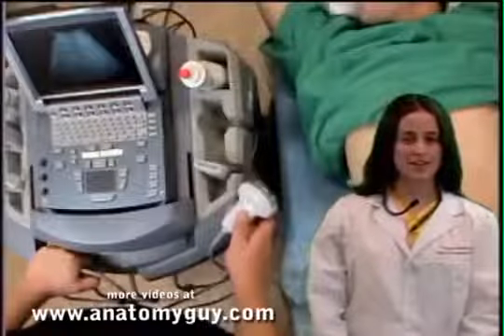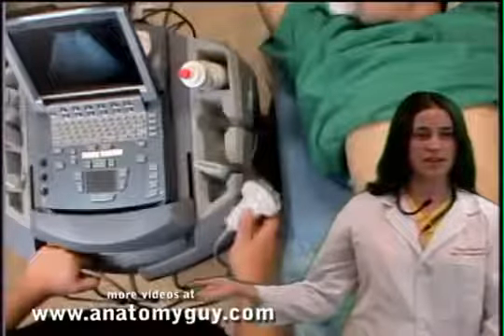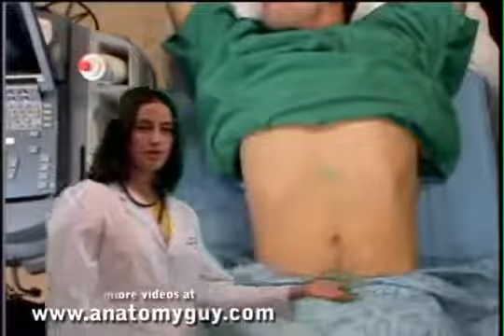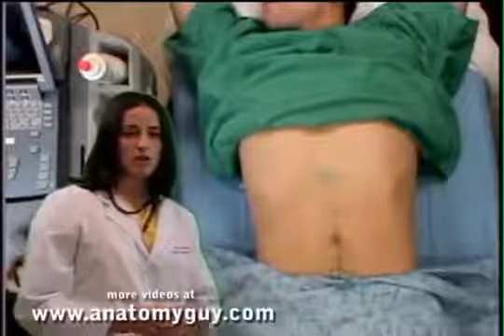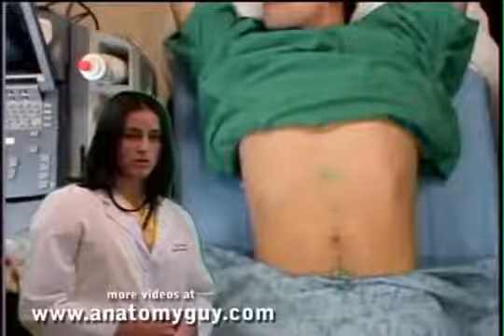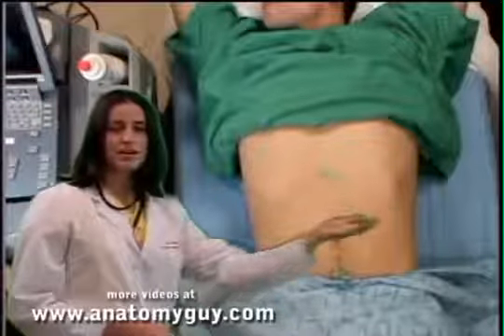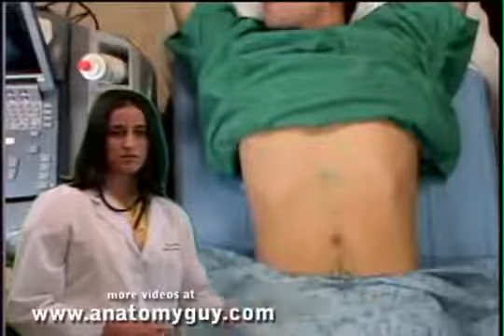For our FAST exam, we have our bedside ultrasound machine and Dr. Byers' hand, and in his hand is our curvilinear probe. We also have our patient, and for our FAST exam, we need to look at 4 areas. A subxiphoid cardiac window, which is this gel there. Also, we need to look at Morrison's pouch, or the hepatorenal recess, which is this blob of gel, and the splenorenal recess at this blob of gel, and the pelvis.